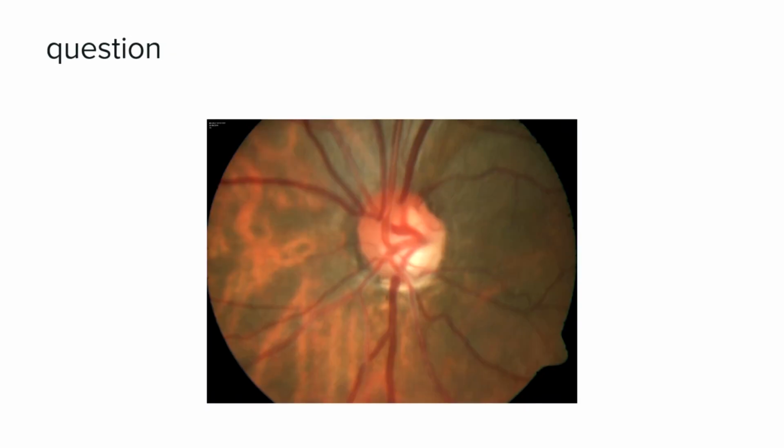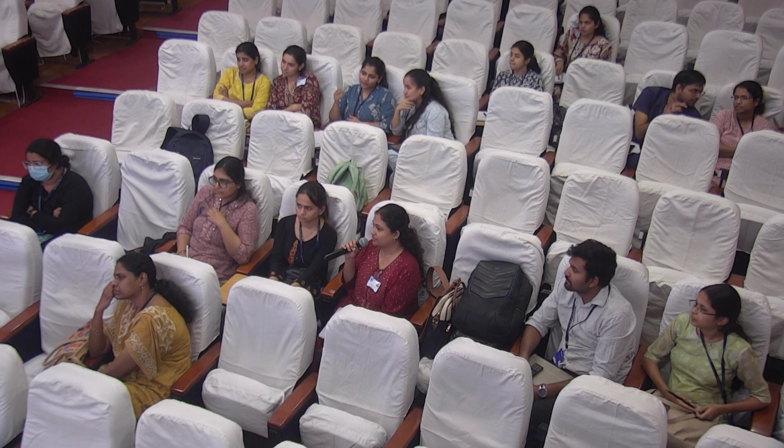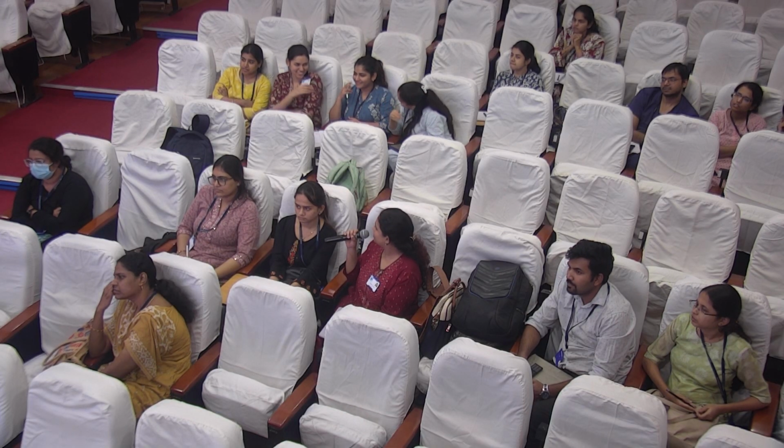Ma'am, the size of the disc is average. A tilt is present. It is asymmetric. The margin is asymmetric? You're not comparing it, no? The shape, yeah. Sir, the ISNT rule is also not followed. There is thinning, inferior, superior, what is there? Inferiorly, there is a notch. Yeah, there is a notch. Superiorly also there is an early notch.